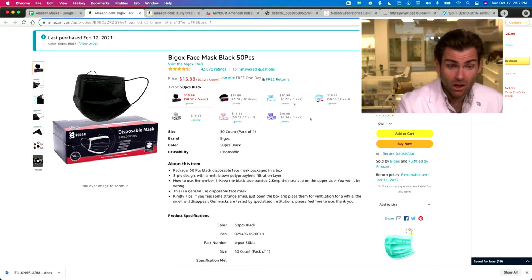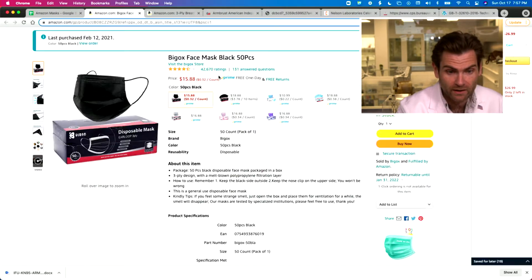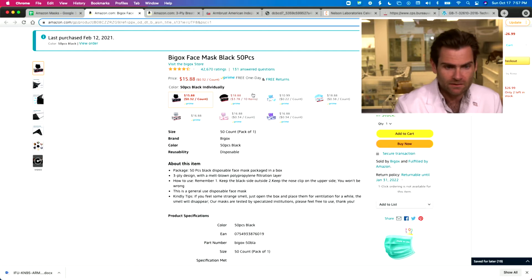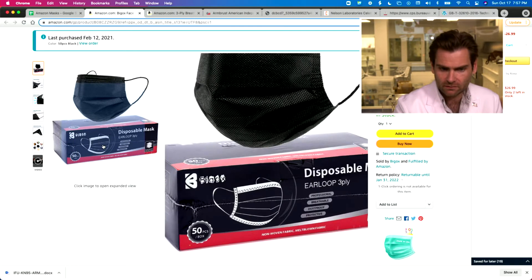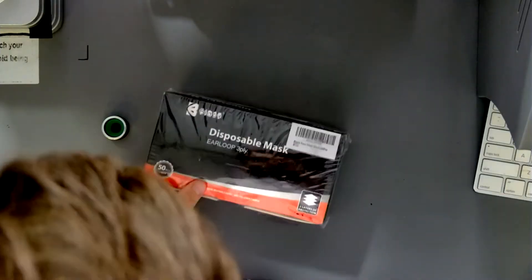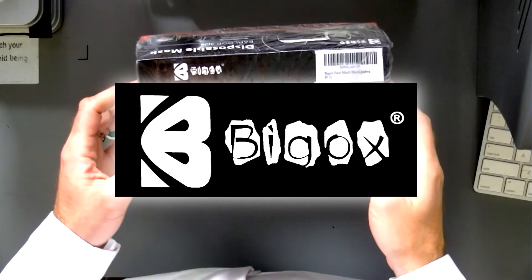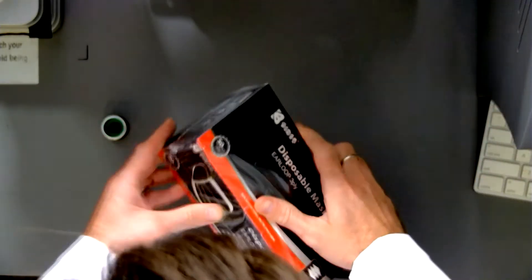Look at the Big Ox mask — 42,000 ratings, that's a lot of ratings. This is the 50-piece black version. I don't love the packaging honestly. Let's look at the box in real life — that's the logo. Really? That's what you went with? I do like the overwrap though, that's nice.